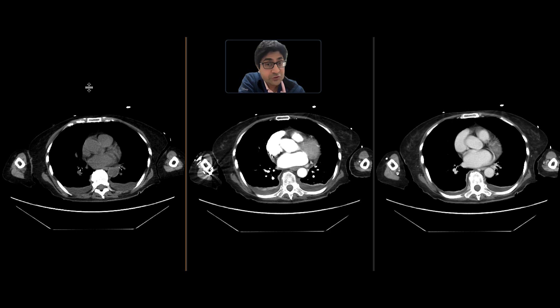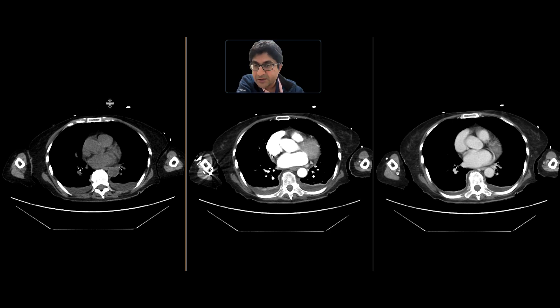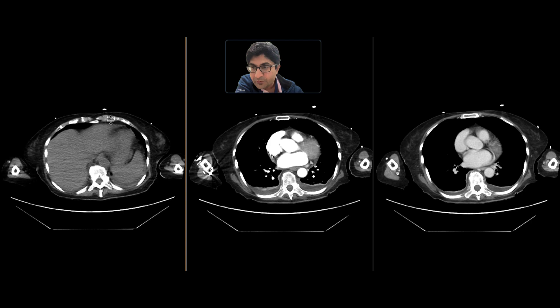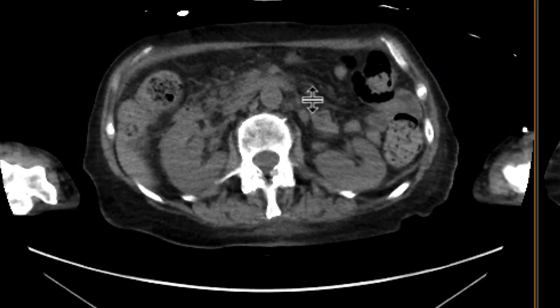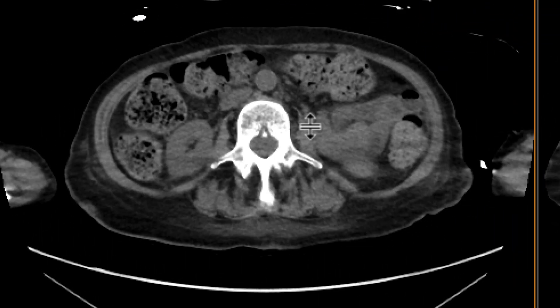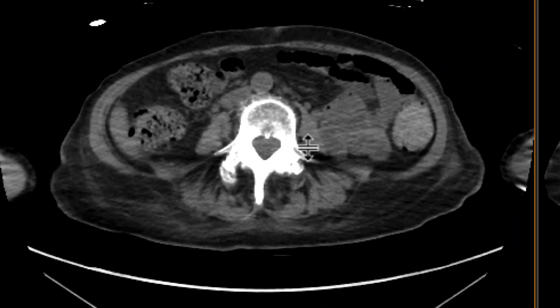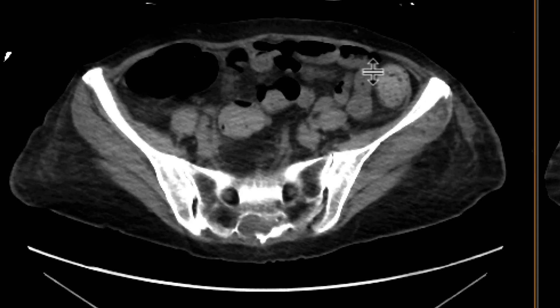This is a patient who comes in with GI bleeding who got a CT scan — a GI bleeding protocol with multiple phases. We start off with our non-contrast phase to see if there are any areas of high attenuation. It also serves as a baseline for the post-contrast phases to come.